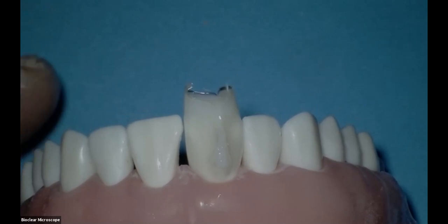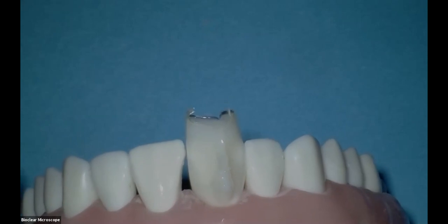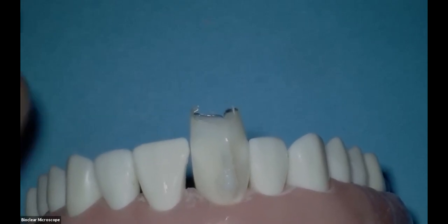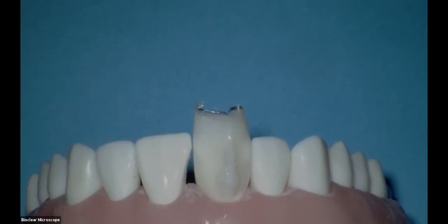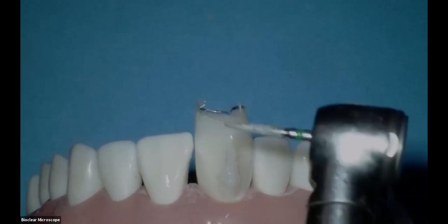The best way to stop bleeding is direct pressure, and that's what the matrix does. So now what I want to do is finish the procedure quickly because we need to get to Disha, and then we can answer some of these questions as we go along, because I don't want to not get done here. So let me go ahead and we're going to bring in the burr.